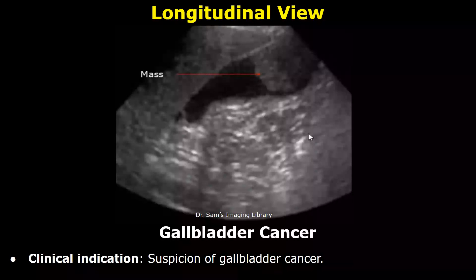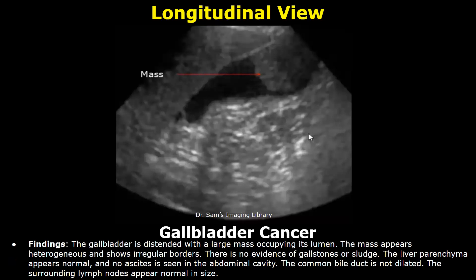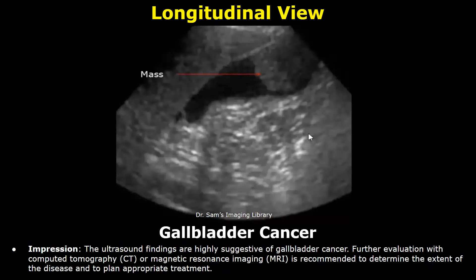Now we will look at gallbladder cancer. The clinical indication here is suspicion of gallbladder cancer. In the findings, you can write a large mass occupying the gallbladder lumen — the mass appears heterogeneous and has irregular borders — and then write about any gallstones or sludge. In the impression, you can write the findings are highly suggestive of gallbladder cancer, and further evaluation with CT or MRI is recommended.